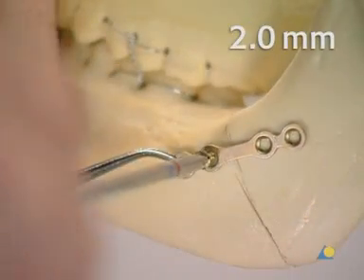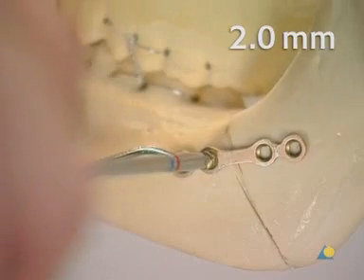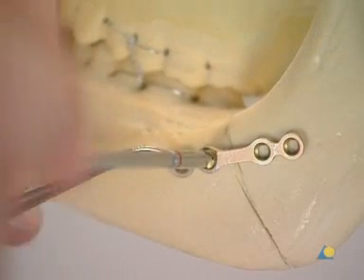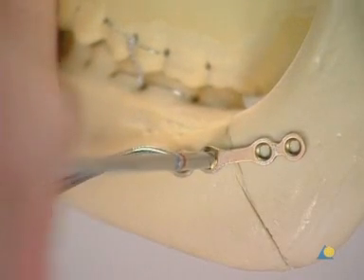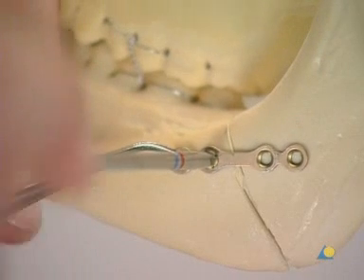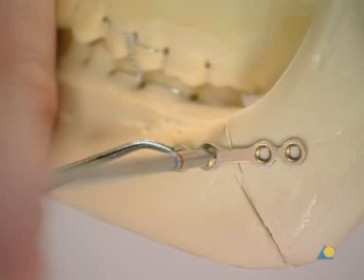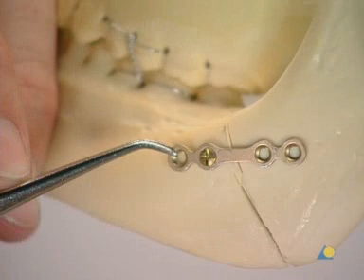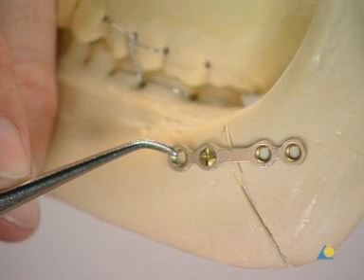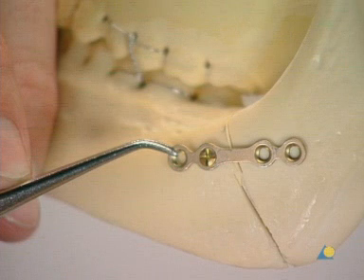A 6 millimeter long, 2 millimeter screw is now inserted, but not fully tightened, so that the plate can still be adjusted. Sometimes it's useful to insert the first screw into the proximal segment first, so that the plate can be used to reduce the condyle-bearing fragment.